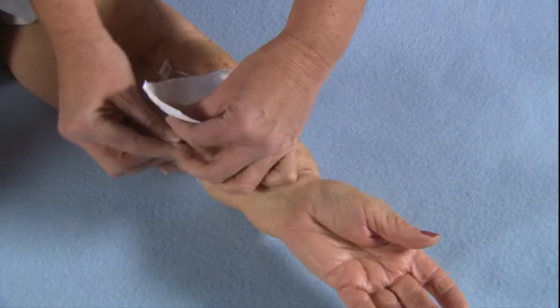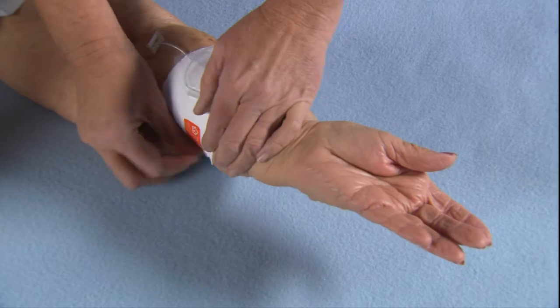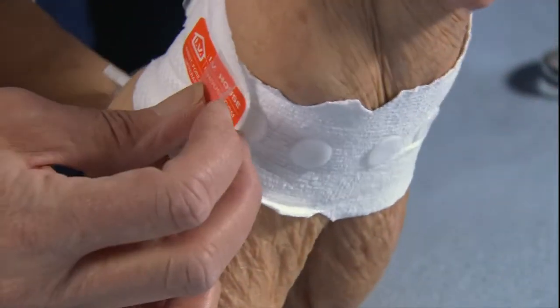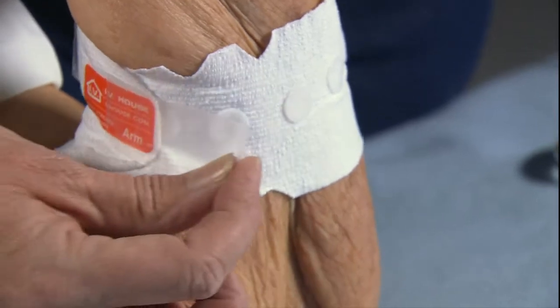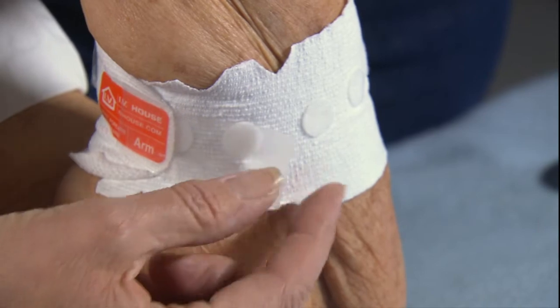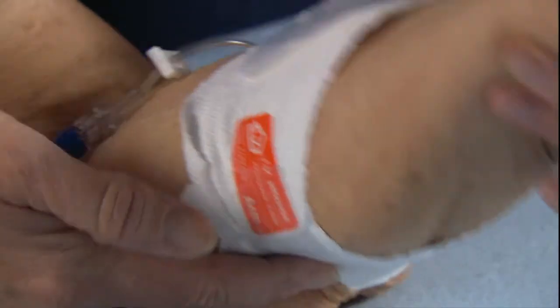Close with Velcro. A piece of tape on the fabric may be used for a more secure closure. Fold back the end of the tape to create a tab — later, this will make finding and lifting the tape easy.